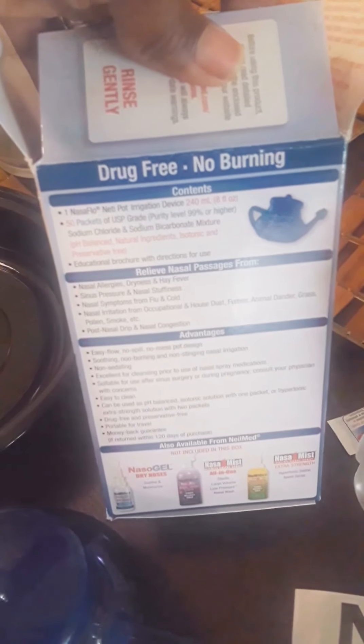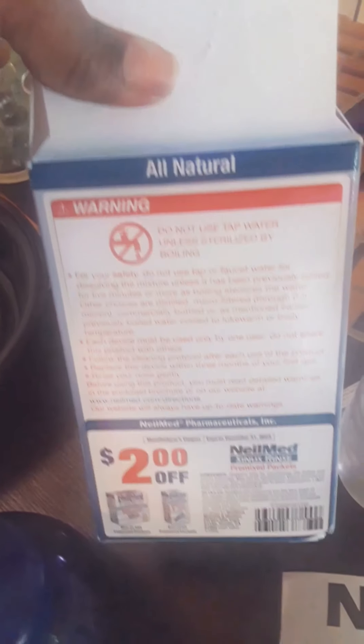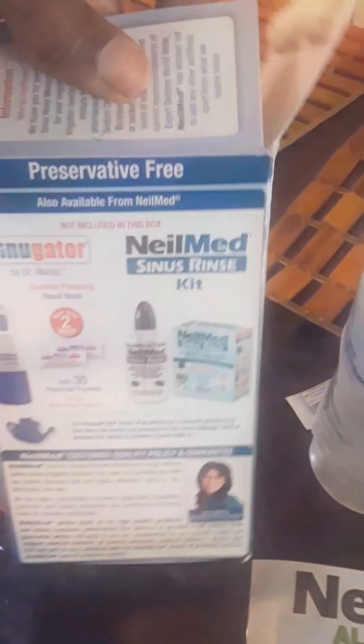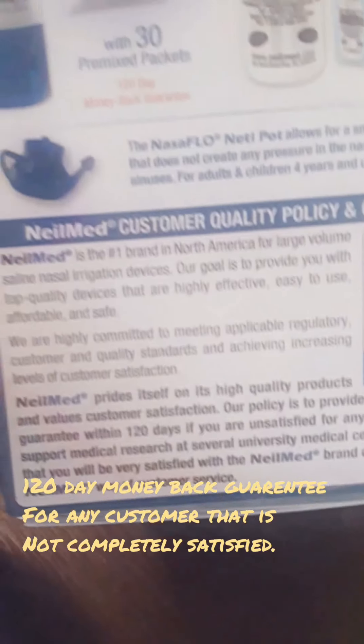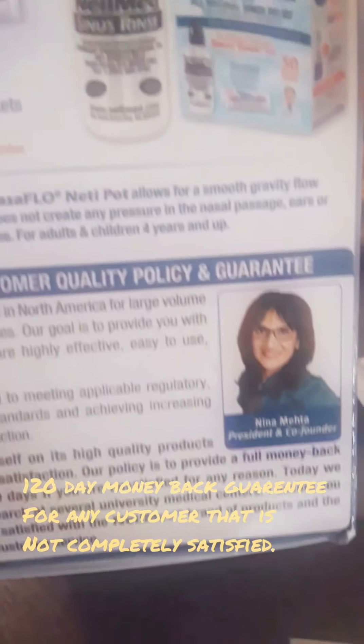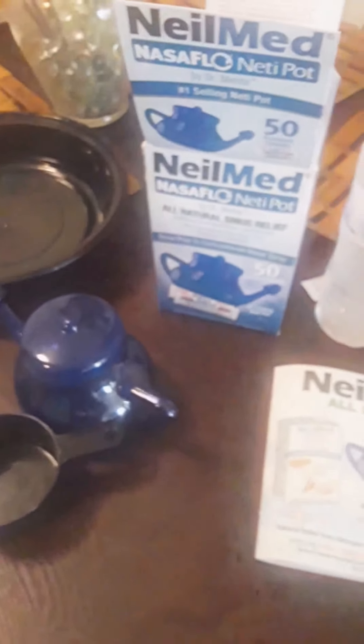The box says it's drug-free with no burning. It goes through what's inside, and there's a warning not to use tap water — they suggest not using that. There's even a coupon inside, which I might use if this works. These are the different types, and here are the co-founder and president on the box.